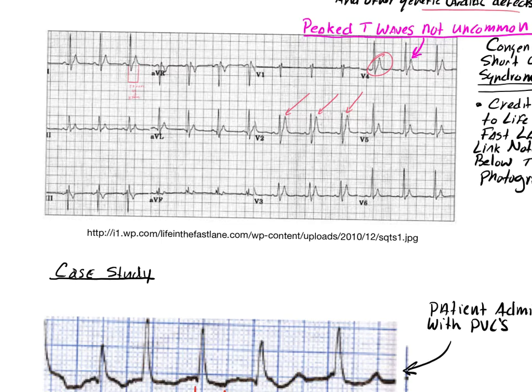Or let's say you have somebody who you found down at the grocery store. They're lethargic, they're diaphoretic, they're in an SVT. What do you do? You cardiovert them, and they go into a sinus rhythm, and then you're done, right? Hooray, I did my job, let's transport, right? No, you should do what? You should run a 12 lead on them, and you're looking at the 12 lead, and you go, ooh, get that QT interval. And you start talking to your patient, hey, has anyone else in your family ever had a problem like this? Oh, yeah, my little brother died when he was really young.